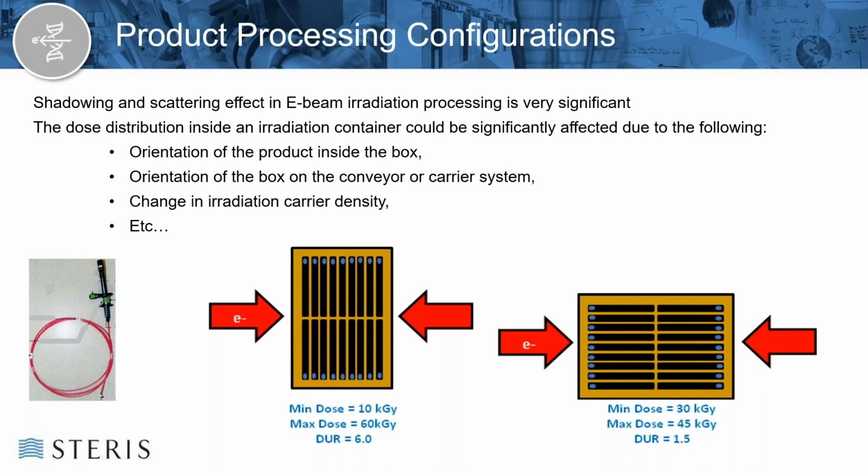And that could be, oftentimes that might occur due to the mass distribution as viewed on the surface. Think as if you did an X-ray, like a human X-ray, but now you're X-raying your box carton, and looked at that picture to see where the high density and low density areas were from that one-dimensional view. And if you have a more uniform picture, then you should overall get a better DUR in a given dimension as compared to that X-ray picture in the other direction.